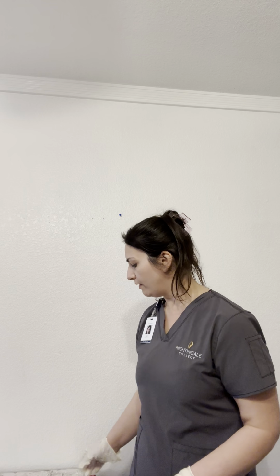And we are going to go over the tubing. We have primary and secondary tubing, each with a 15 drop factor. Next, I'm going to talk about the primary tubing. We have a spike end here, and this is where we connect the medication. We want to keep this sterile until we get started.